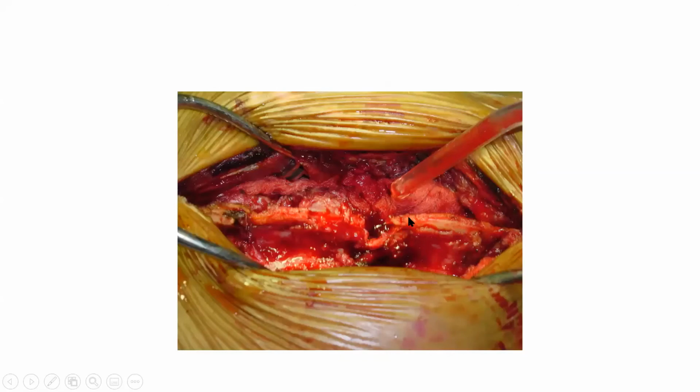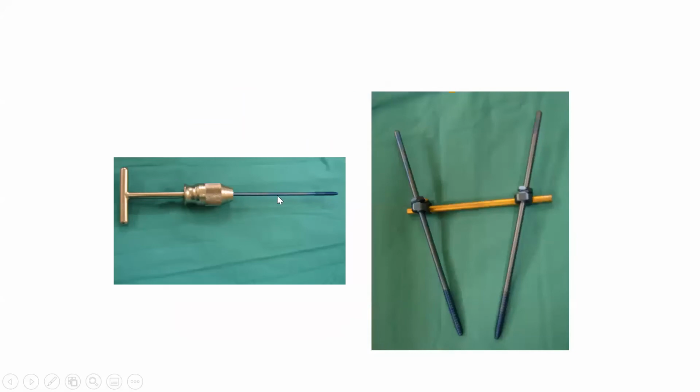So there are the spinous processes, and there's a defect in the ligament; it's torn. This is the typical patient: you feel a gap in the back with the thumb, and local tenderness. He's unstable, so it's an anterior and posterior column injury. There are these beautiful Schanz pins, and they have a polyaxial connecting device which goes onto the rod and allows you to move them in different planes.